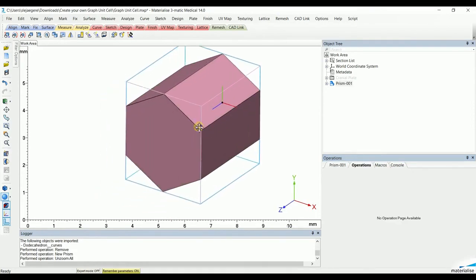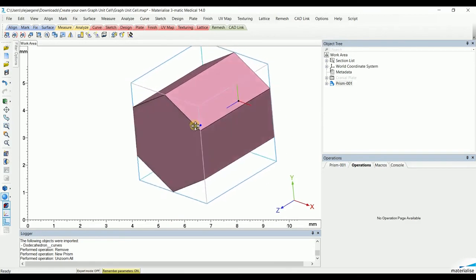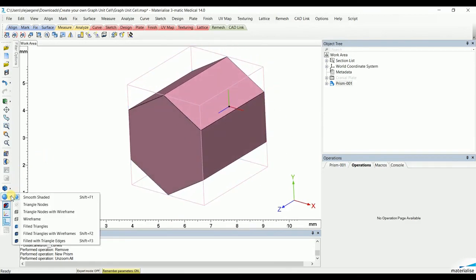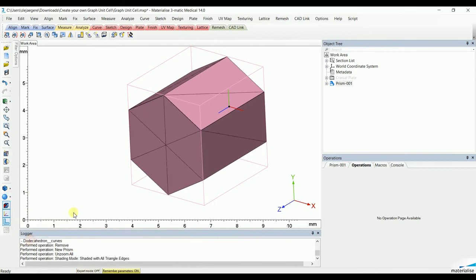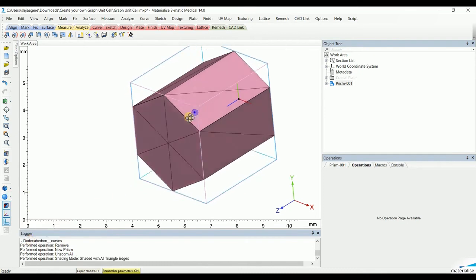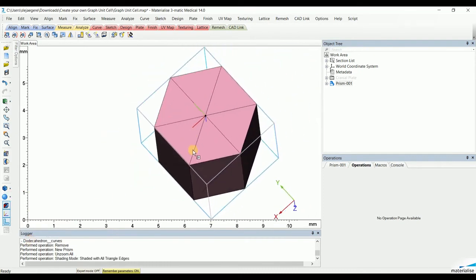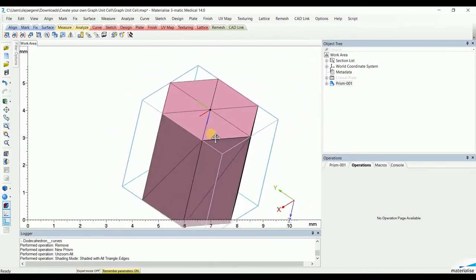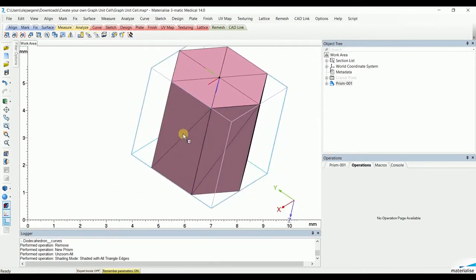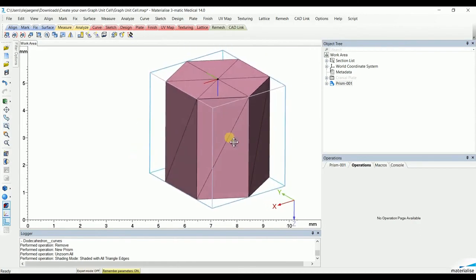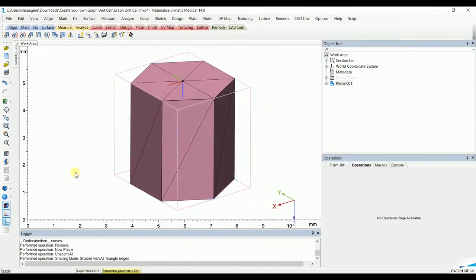Now, if we visualize the triangles, we can already see the guideline of how our graph unit cell will be created following this skeleton of the base primitive.